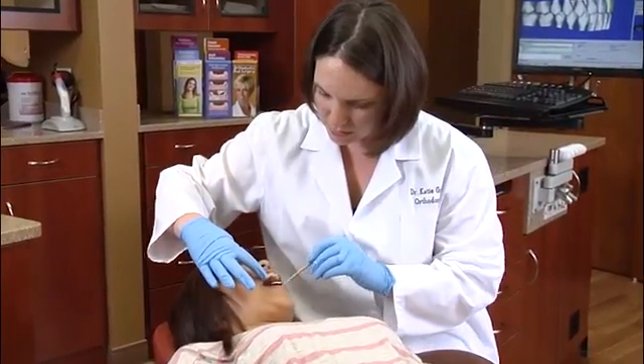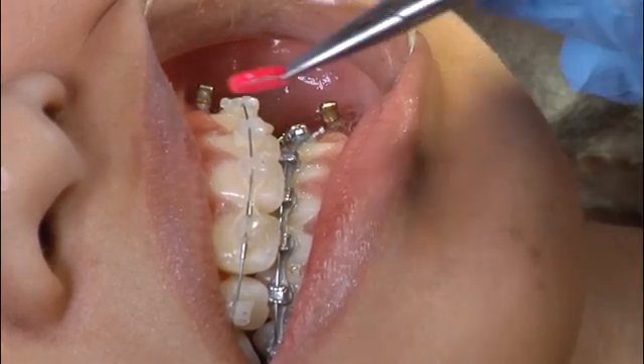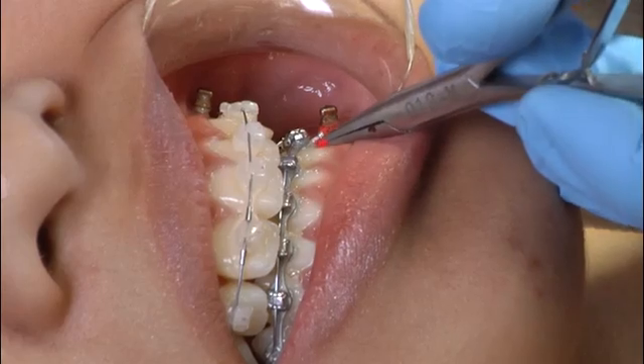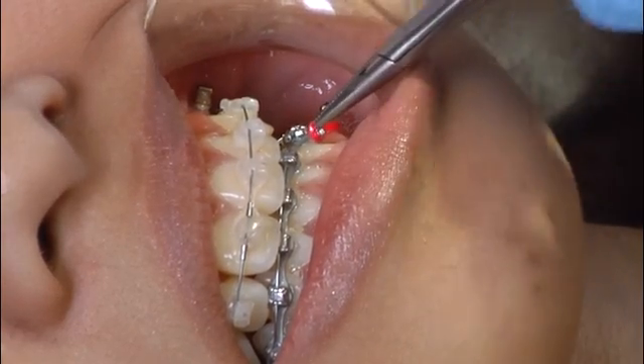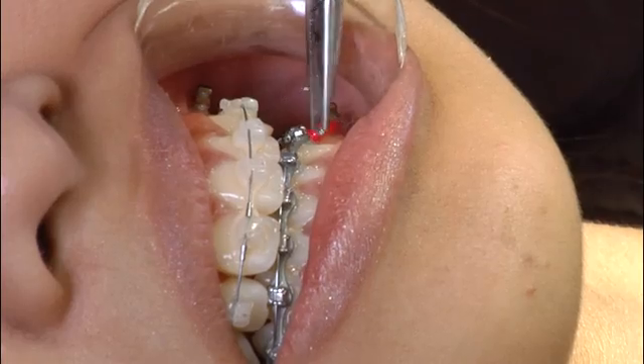Infected and inflamed gum and bone tissue can weaken the TAD and it may need to be removed. A TAD may also come loose over time — remember, it is a temporary implant that may lose its solid feel and need to be replaced. TADs contribute to predictable results. They allow an orthodontist to move teeth in directions that just appliances on teeth cannot accomplish. TADs can shorten treatment time and may be used in patients of any age and in many different areas of the mouth.